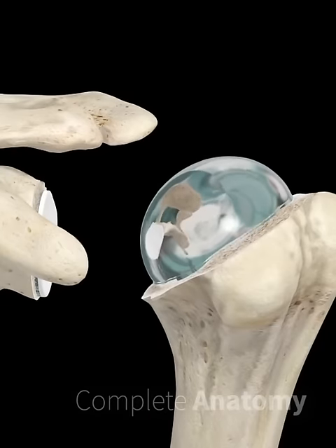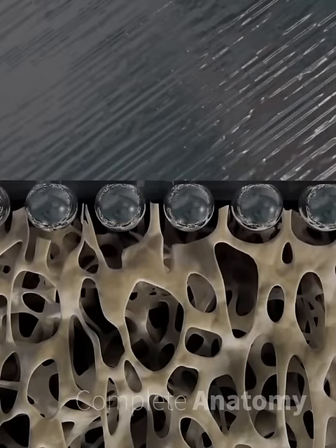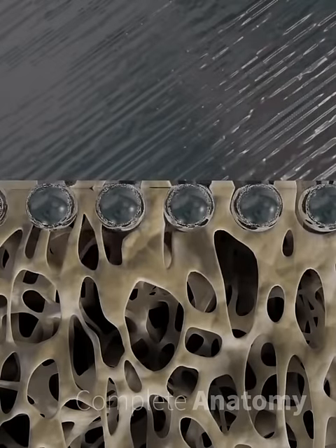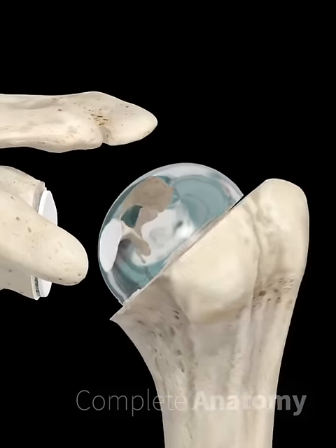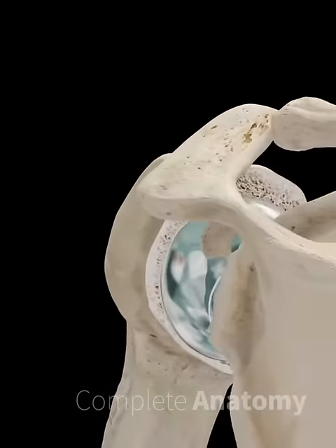This stem is impacted onto the humerus bone, anchoring the prosthesis. A metal head is attached to the stem. Contact of this porous metal with the bone stimulates osseointegration, forming a strong direct bone-implant interface without the need for cement.